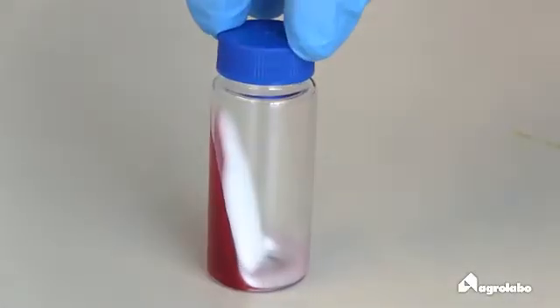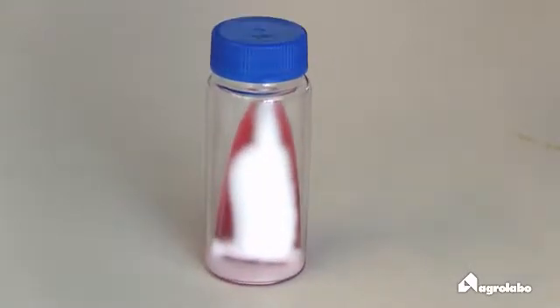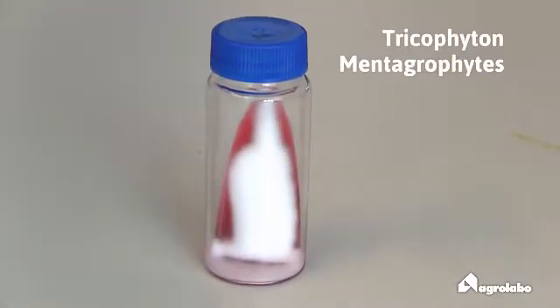The colony is grainy, flowery, feathery and cottony. The color is white and then yellow and rose. Reverse side: rose-brown.